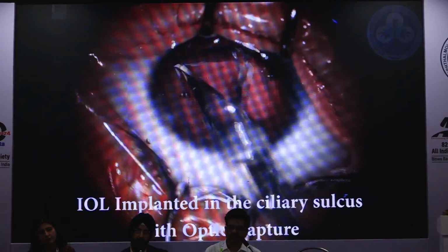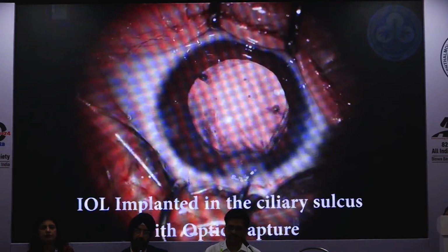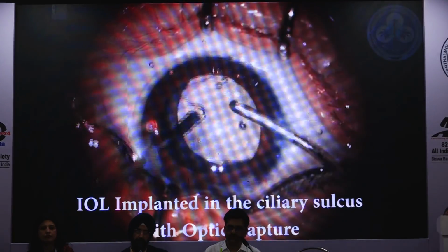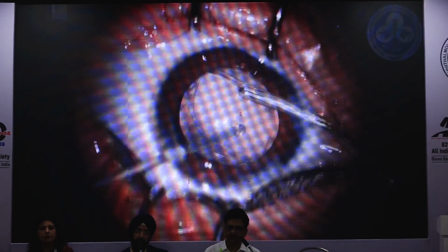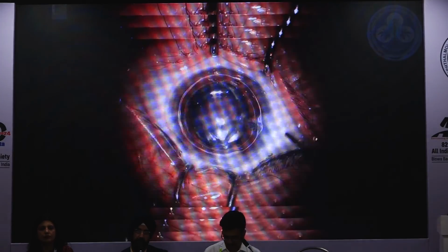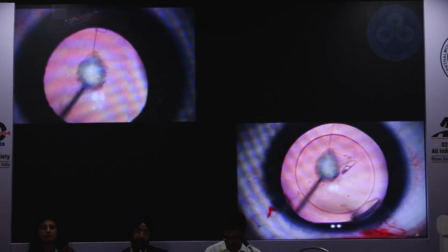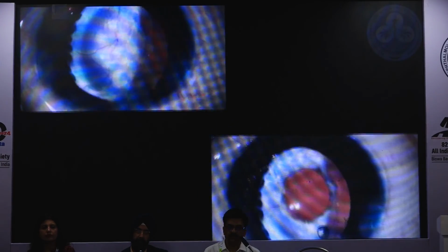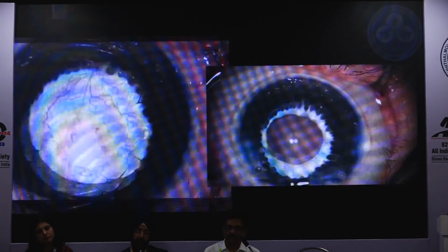And here we can do optic capture again, optic in the capsular bag and haptic in the sulcus. So these are some of the other cases of PHPV. Classical PHPV, this is a very advanced PHPV where the posterior capsule is totally vascularized.